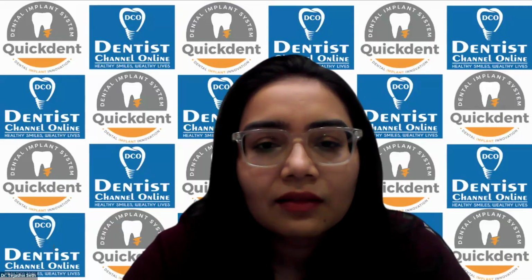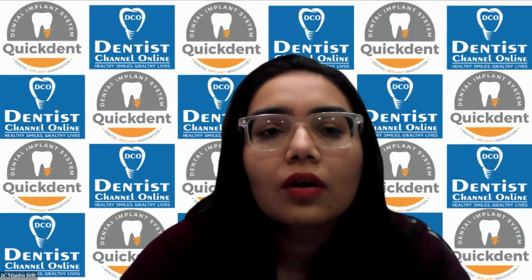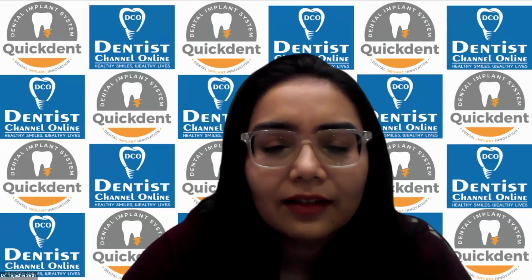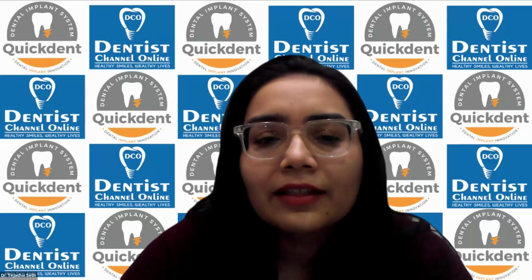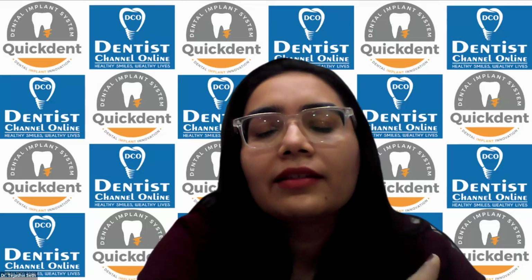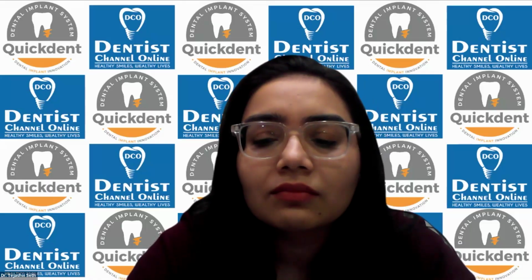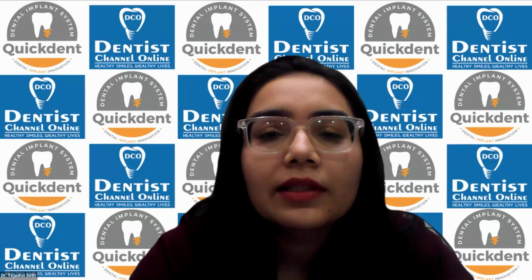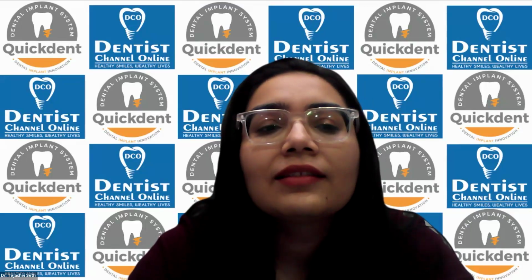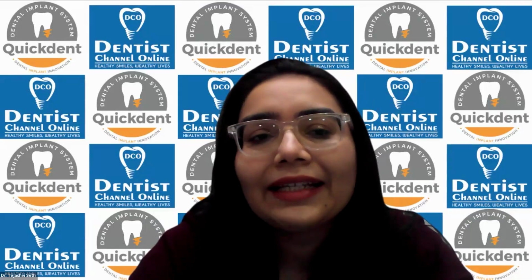The earlier studies have shown that there's hardly any significant difference in crestal bone loss, and the more recent ones show that there is a certain amount of difference, as in it is less traumatic and the crestal bone loss is less. So there is a confusing amount of data on what you should go for. The basic prerequisite comes down to whether there is an adequate amount of keratinized attached non-mobile tissue, which should be at least 5.